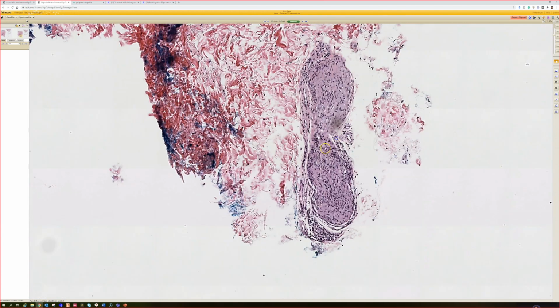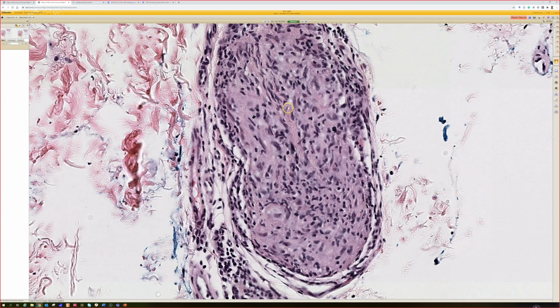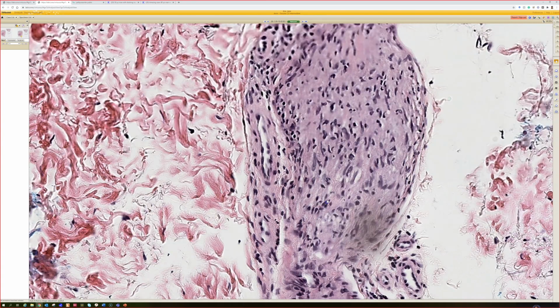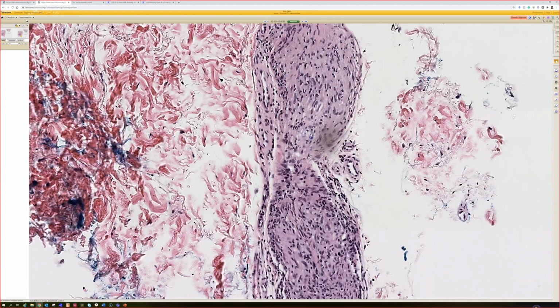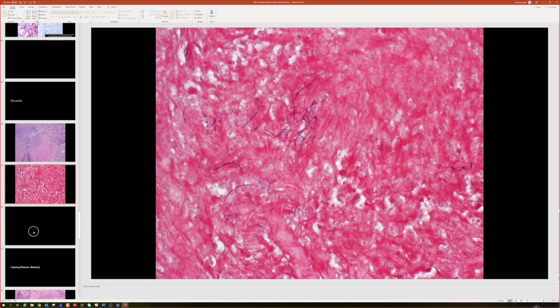And here's one that I think is actually around a nerve more obviously. Right here, this little slightly wavy collagen structure in the middle probably represents, I can't be sure on this scan, but I bet you this is a small nerve, and the perineurium is totally distended by histiocytes, right? So this is kind of a tight granuloma, tightly cuffing around the nerve, and it's kind of linear and elongated. That's classic for leprosy, tuberculoid or pauci bacillary leprosy usually.